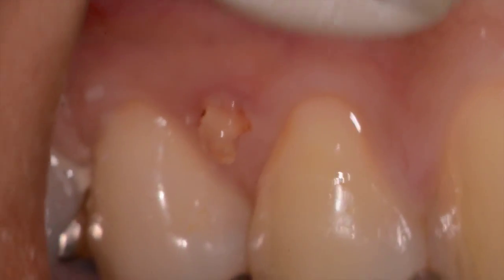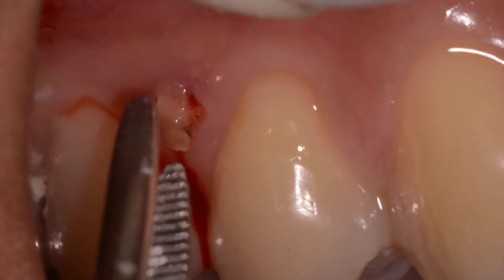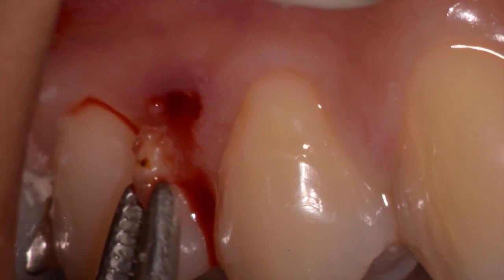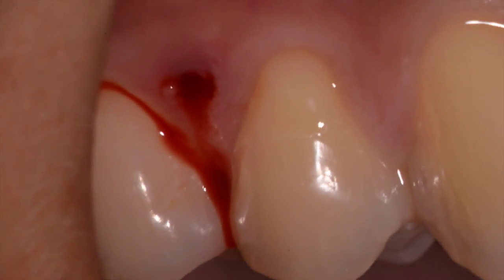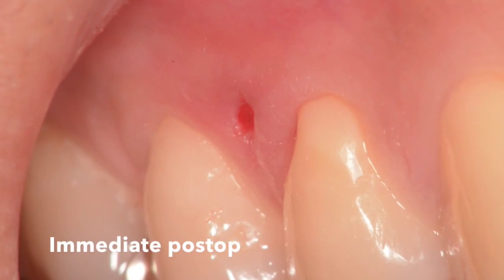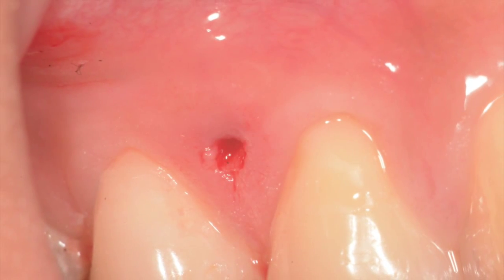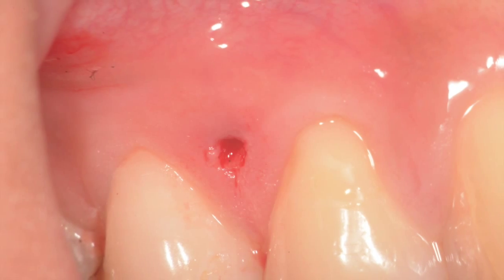We grab the root tip with a pair of cotton pliers just to remove it. This is immediately postoperatively — you can see there's a slight amount of bleeding in the attached tissue, just a small little hole, the same day as the surgical removal of the root tip.